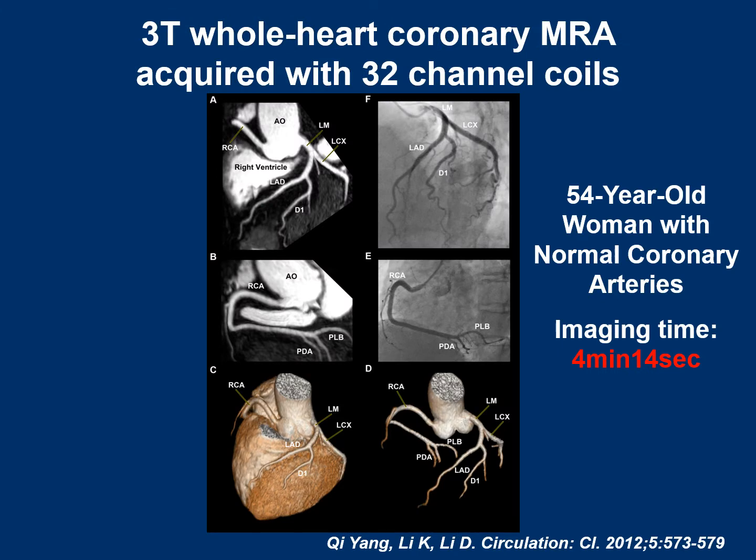We continue to improve the image quality of this whole-heart coronary MRA technique at 3T using 32-channel cardiac coils. This is an example from a patient with normal coronary arteries. This coronary MRA technique clearly rules out CAD with an imaging time of less than 5 minutes.